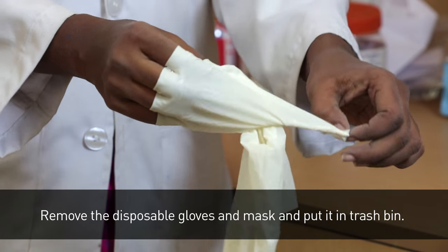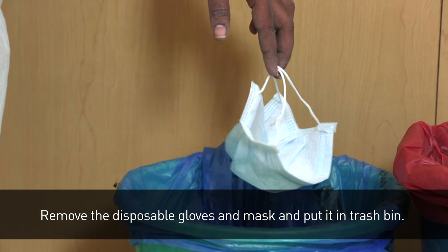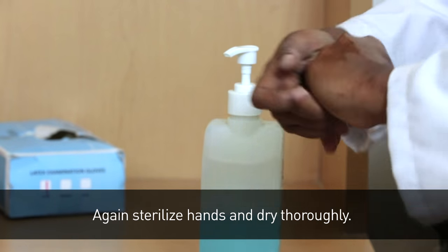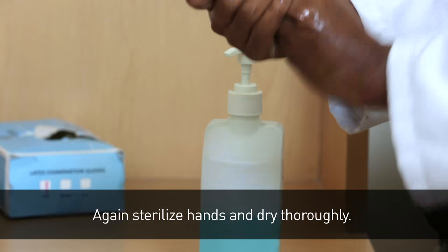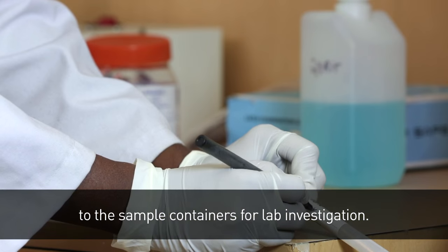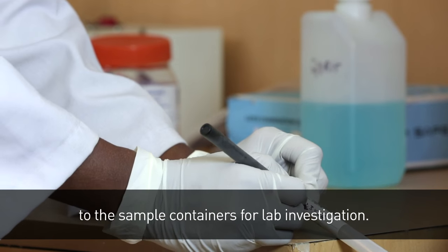Remove the disposable gloves and mask and put them in the trash bin. Again, sterilize hands and dry thoroughly. Attach the lab requisition form with clinical details to the sample containers for lab investigation.